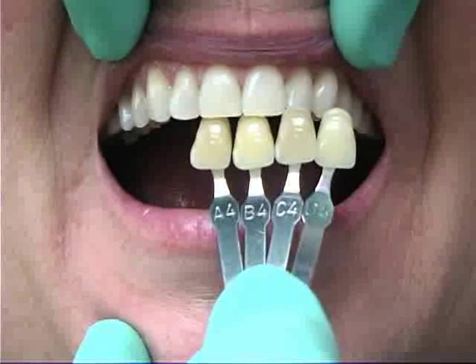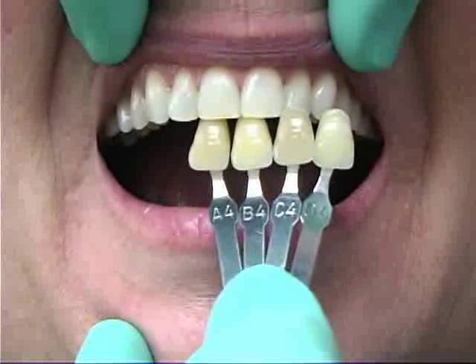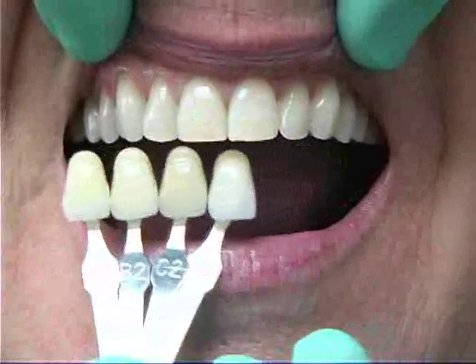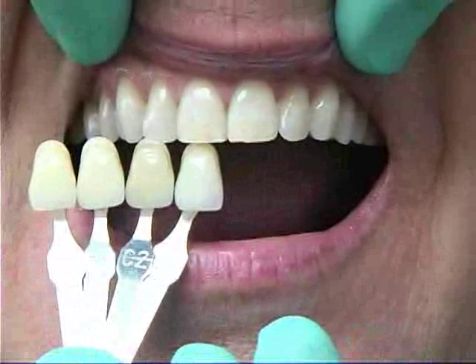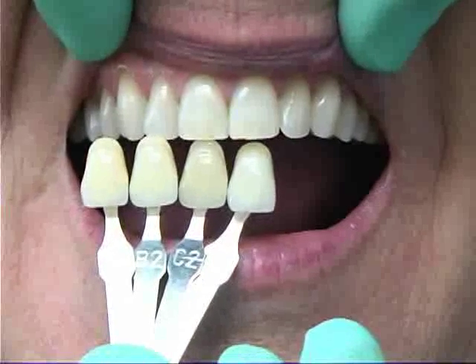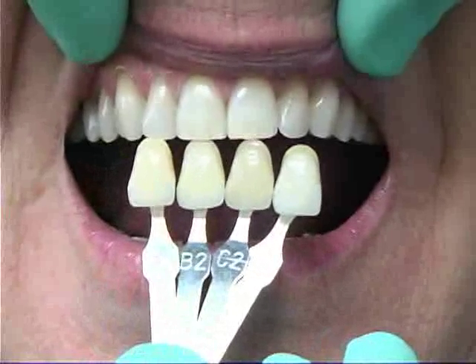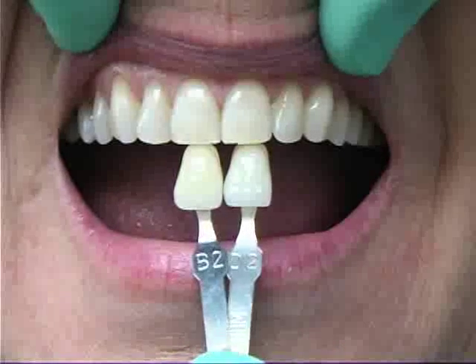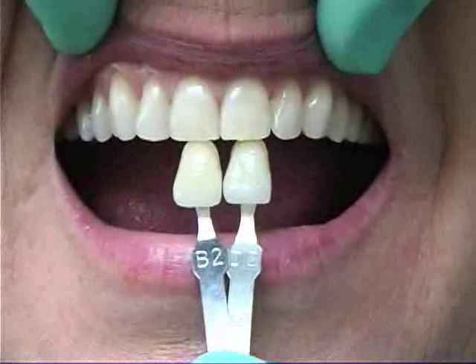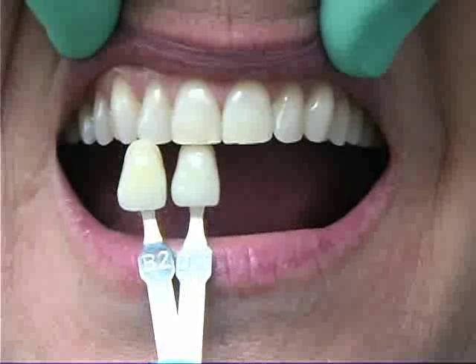However, it can be problematic when the natural teeth have much less intense pigmentation and are much lighter, that is, higher in value. Under such conditions, less intense specimens from each group can be used, such as A2, B2, C2, and D2. While holding the 4 less intense specimens, the ones with the poorest color match are visually eliminated. With this patient, elimination of the poorly matching groups left the B and D samples as the remaining choices. These 2 specimens are held in approximation to the teeth so the best group can be selected.